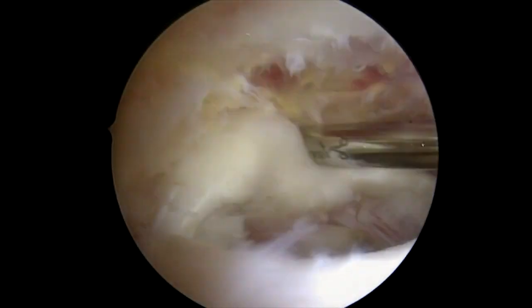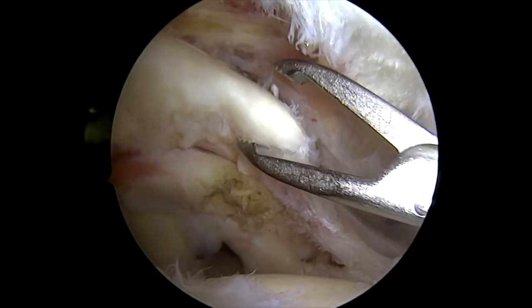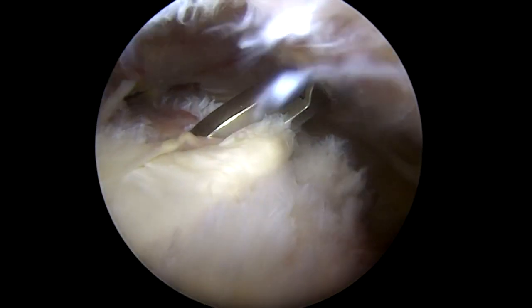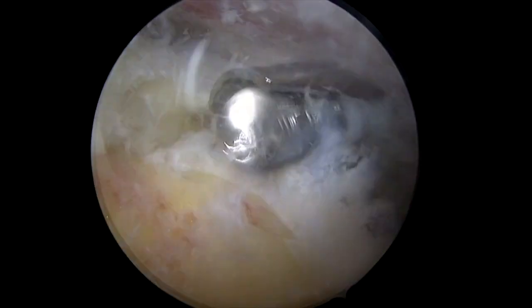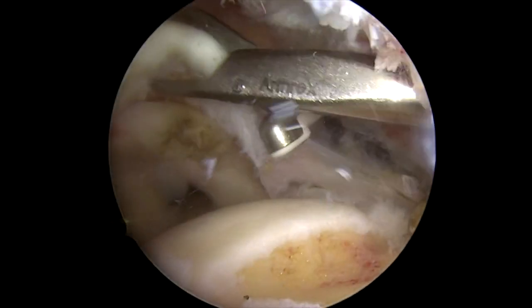We'll also prepare the tendon edge here and then work on top of the tendon to make sure that we have full exposure of the tendon. This is me then pulling the tendon back to where it's supposed to go — you can see it fits perfectly right in that spot. We'll then clear off the bone where the tendon is supposed to be attached, carefully removing all of the stump of tendon, and then pulling that back.